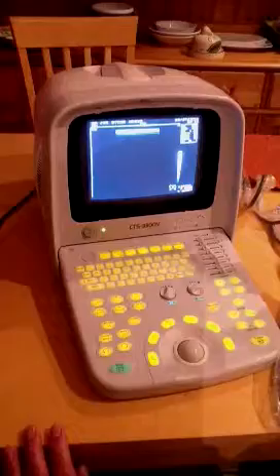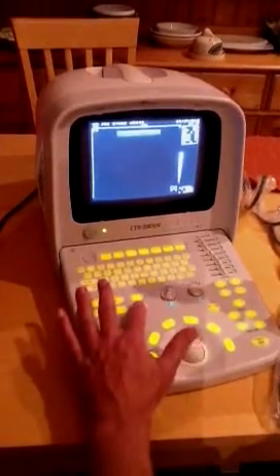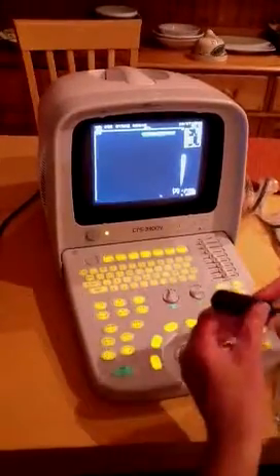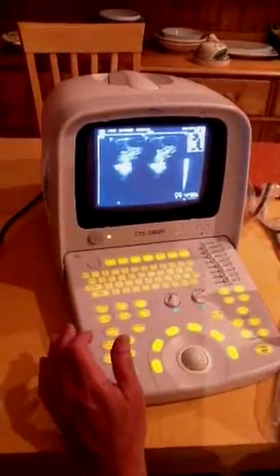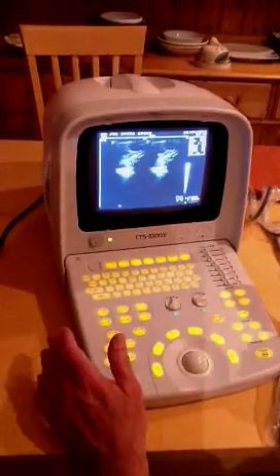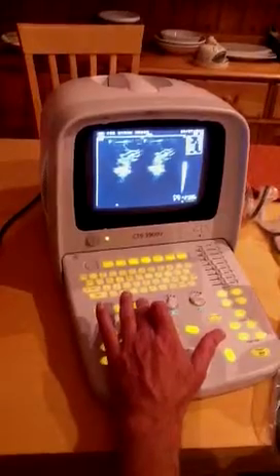The other features on the unit include BB mode, which means you can compare two images. You just press the button for BB, and you have two images so you can actually freeze one image while having a comparison with the live image.